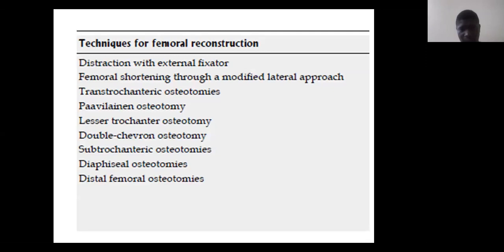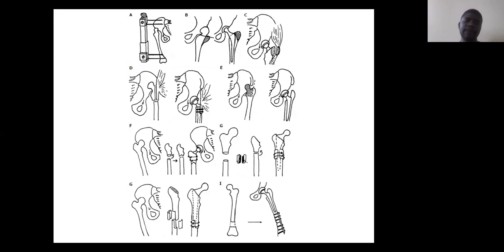And some authors advocate for femoral distraction in those patients with hip dislocation, that's the Crowe 4 and the Hartofilakidis C, to do a pre-op femoral distraction using an external fixator, then proceed with the total hip replacement after. Then some actually go radical to do a proximal femoral preparation, then do distraction, but it has not been shown to be any superior to subtrochanteric osteotomy.